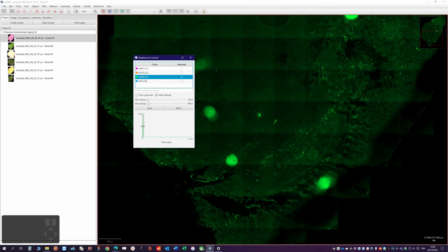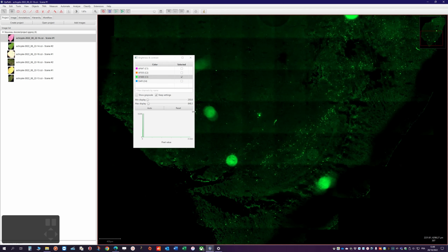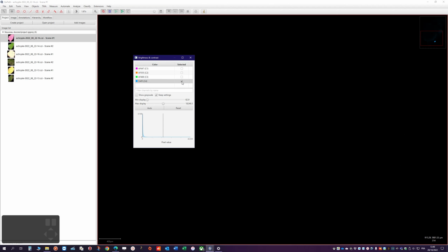It's pretty harsh, although here I got by chance a good result. But anyway, let's start here with 250 and let's increase this a bit to 1000. Looks a bit better.